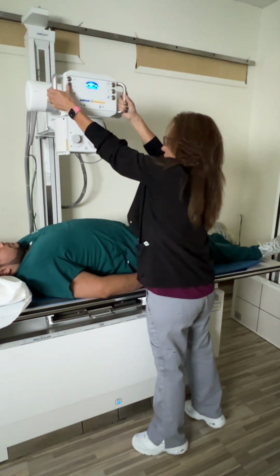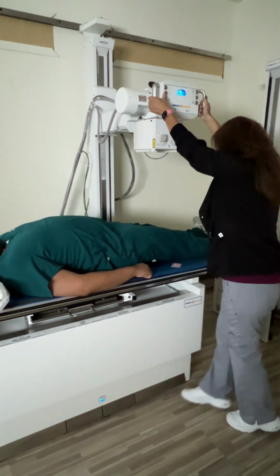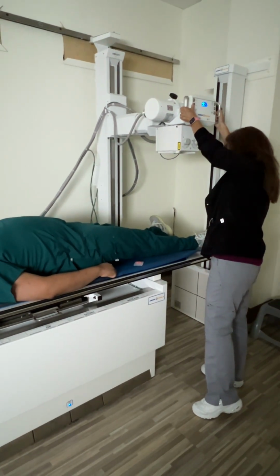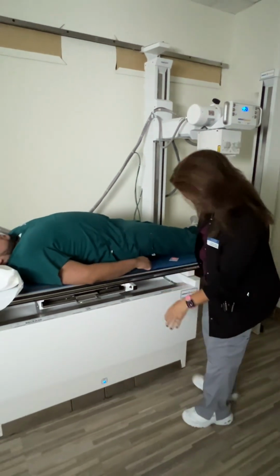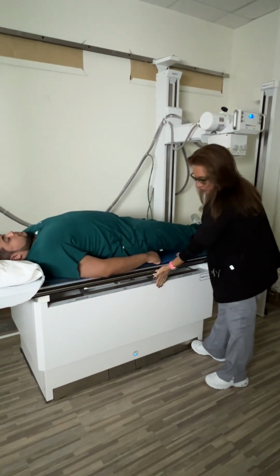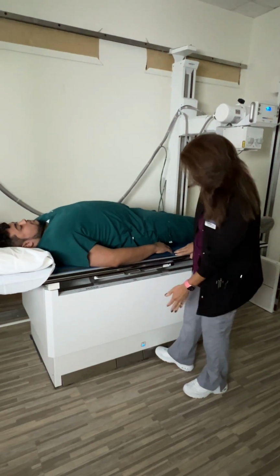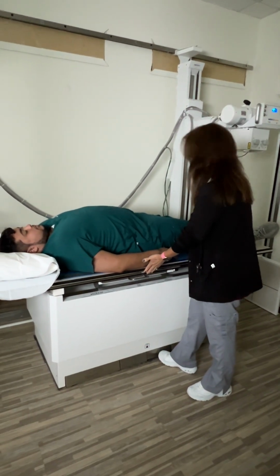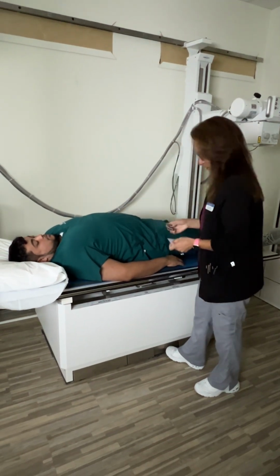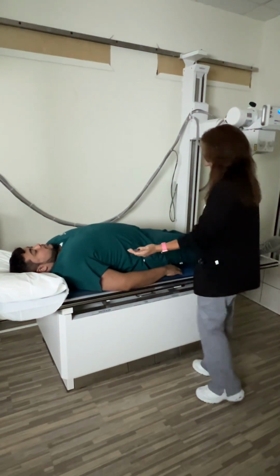and get dressed. When you get a patient off the table, you absolutely have to move the equipment out of the way so that they are not going to injure themselves. And ideally, you kind of wanna center the table back in the middle and bring it over so that he's not going to hit the edge of this. And then I know I brought it down when he got on there, so I'm gonna bring it down again. I'm not going to forget my marker. And then I'm gonna help the patient go ahead and sit up for me.